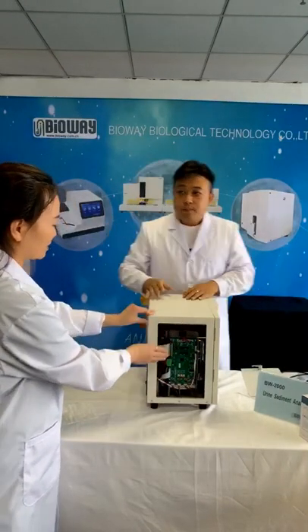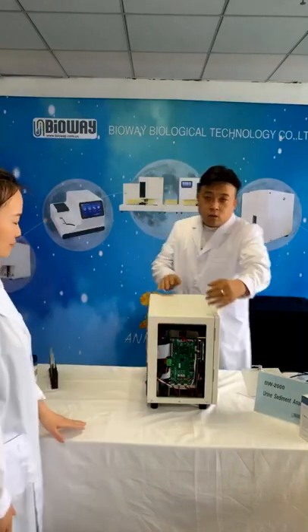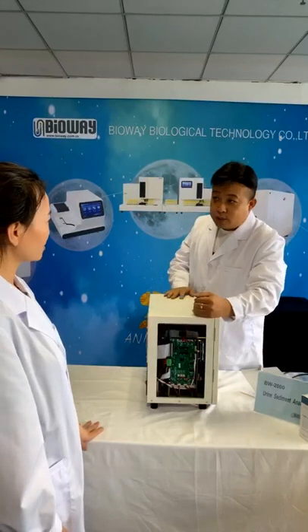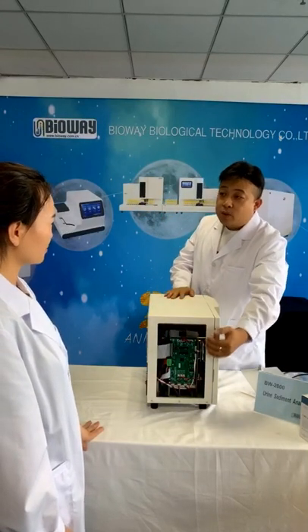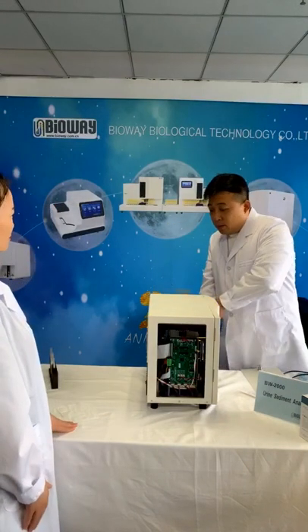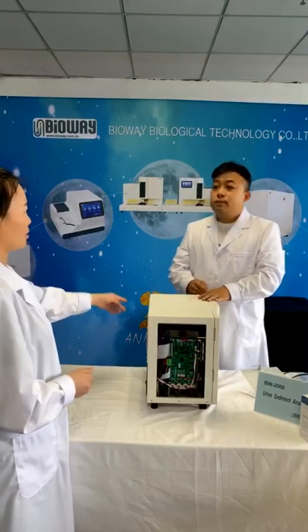The important part, as we said, is the inside PC. Yes, and this side is the brain of this machine. This is the motherboard together. But you can see why the pump is here and the board is here. Do you know why? To avoid the liquid.